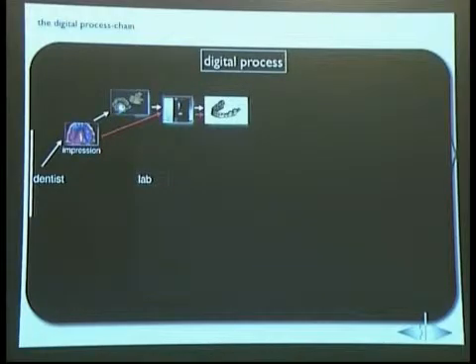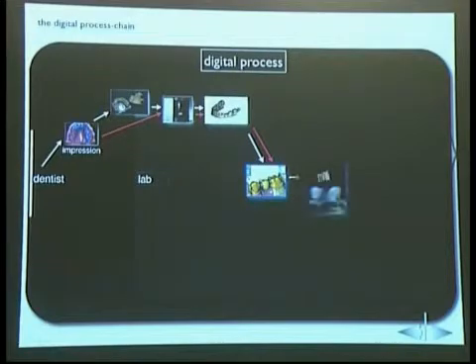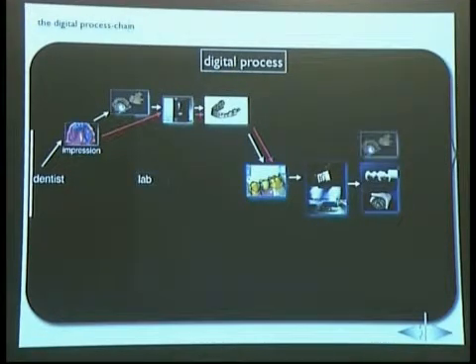Both systems the same. And then we go to the design. Also, if you go the way of the impression scanning, then we get the manufacturing. Also, this will be in this lecture. We get the results done from a machine. We complete them with a model and do the next step, the handwork from the dental technician on this object if needed.